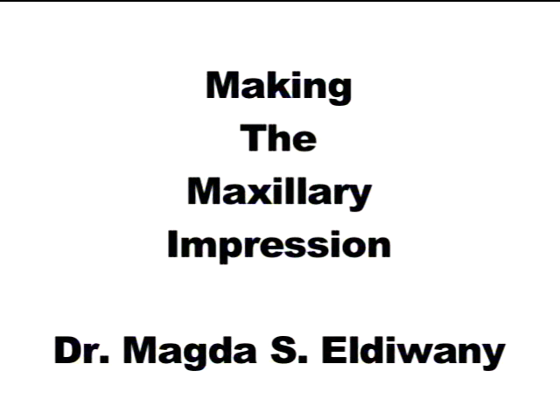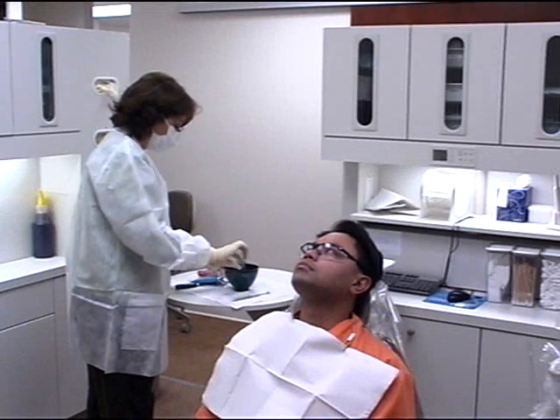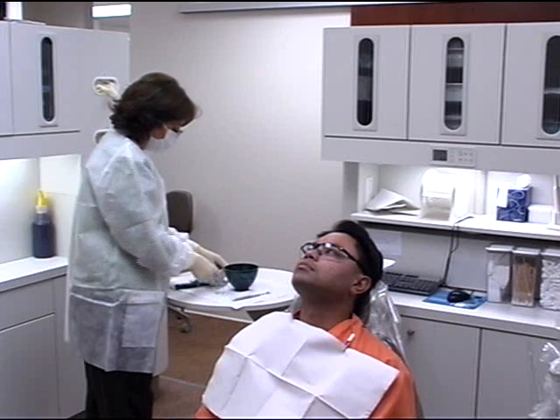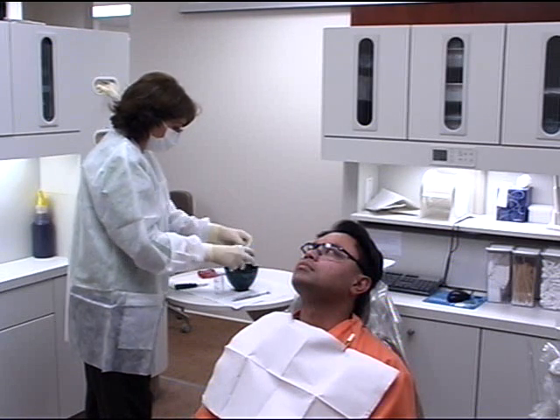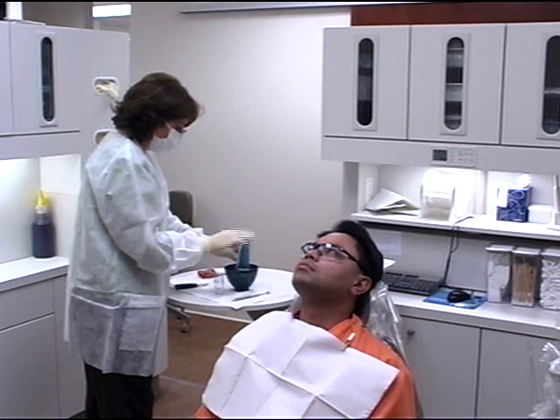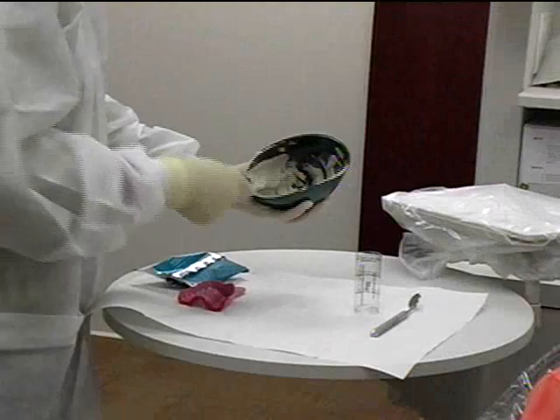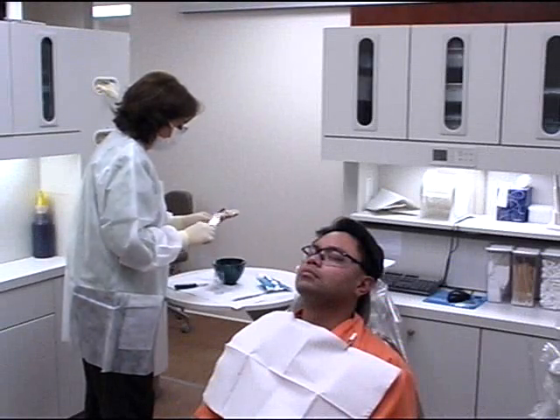Make the maxillary impression second. Again, patients with viscous saliva should first be asked to rinse with mouthwash. Position the patient for maximum operator visibility and patient comfort. Mix the alginate as before. Load the tray and avoid trapping air.